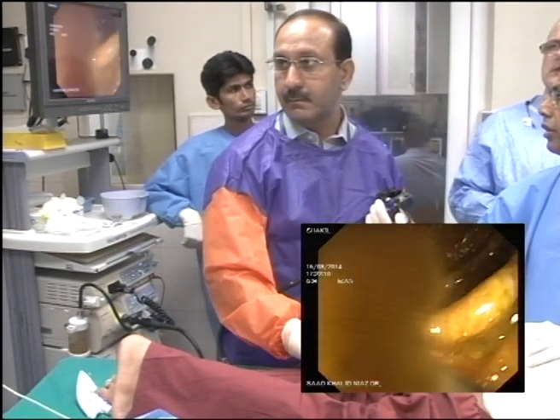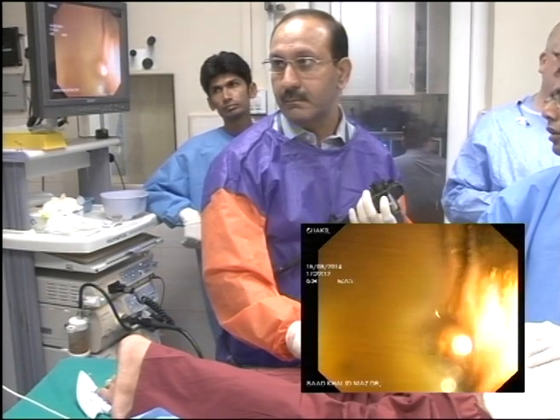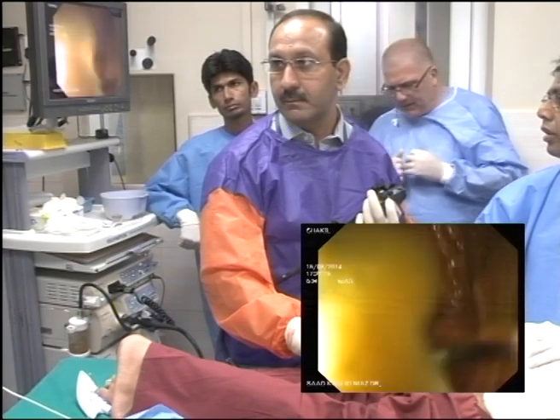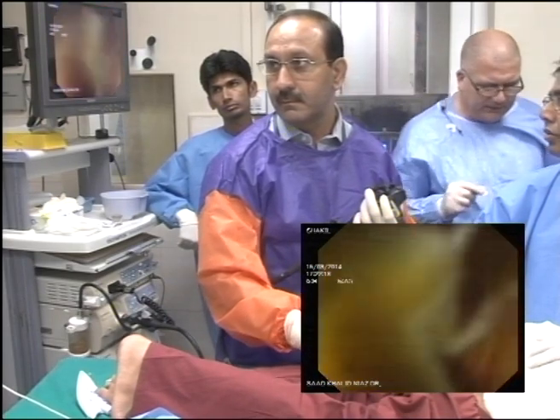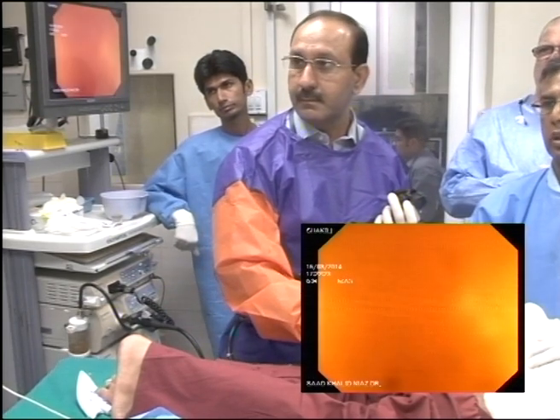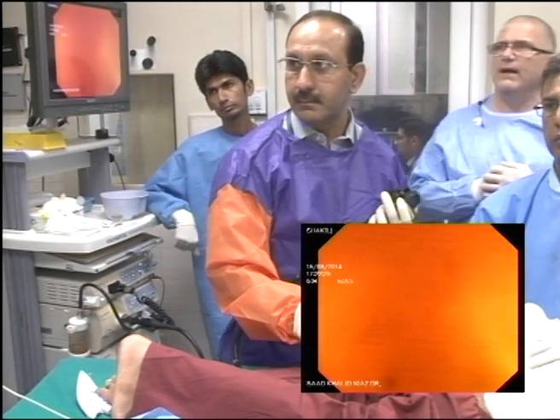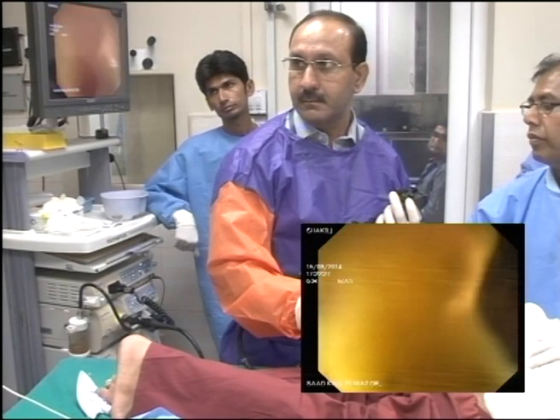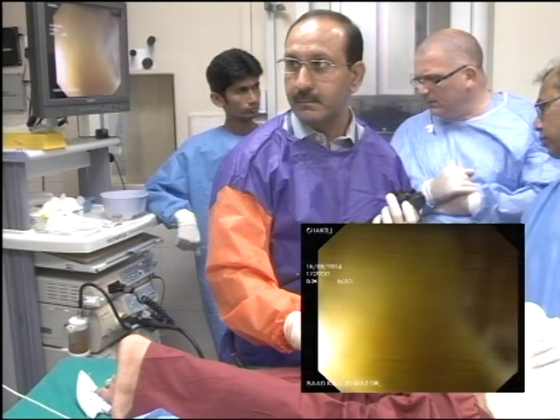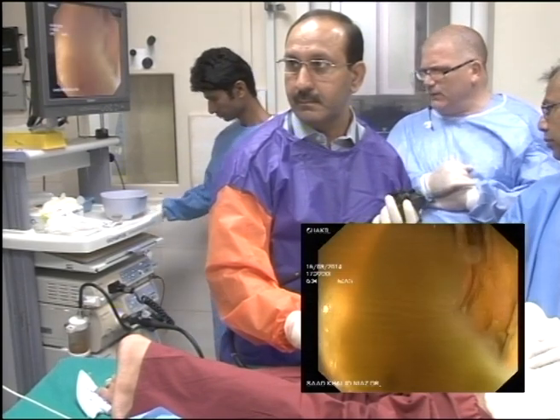Clean your lens. So in this case, it would have been easier if you remember the inner tube thing that we did last time, Saad. This would demonstrate what happened there if we actually could get access to an inner tube at some point. That would show that.